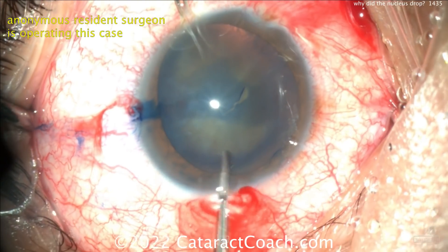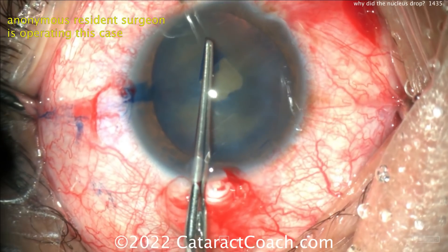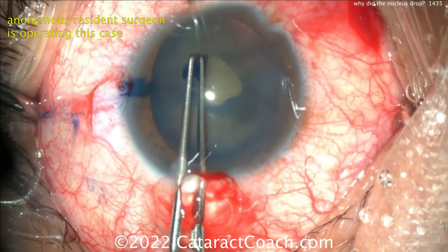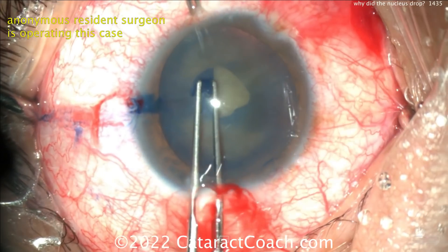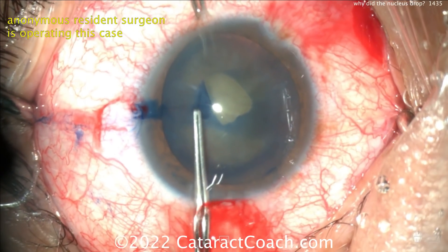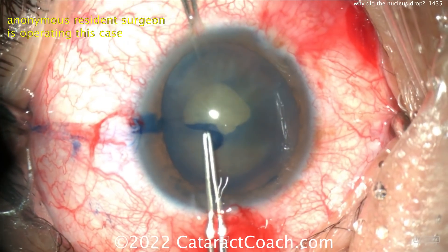We know we're going to have a complication in this case where the nucleus is going to fall into the vitreous. And that's okay! Every single cataract surgeon in his or her career will certainly face a situation where the nucleus drops into the vitreous. It's happened to me, it's happened to all of us. And it's not always the surgeon's fault.